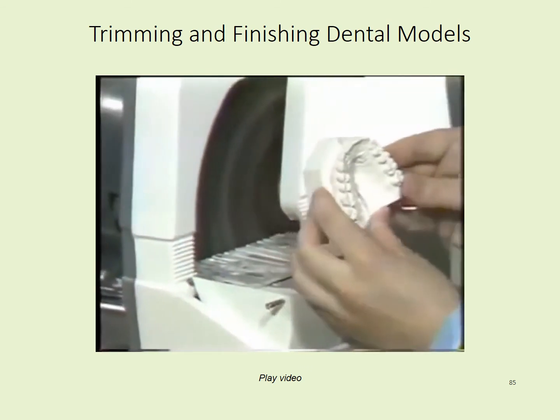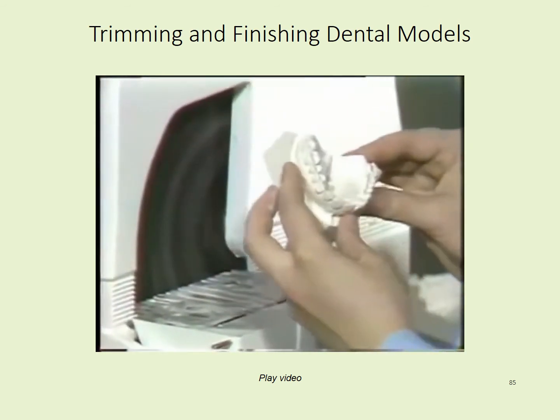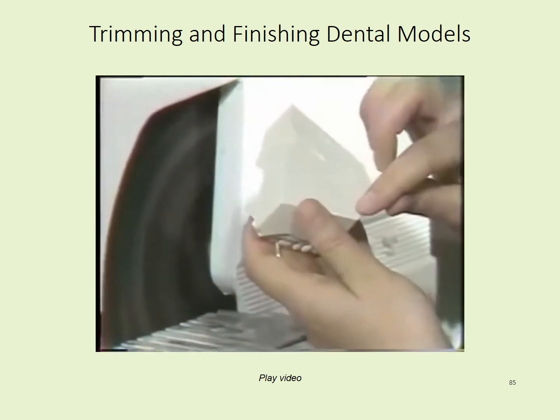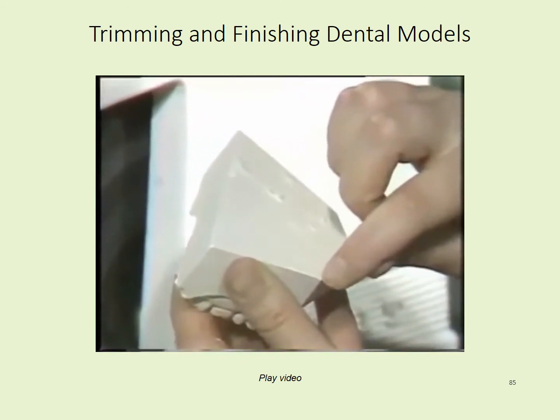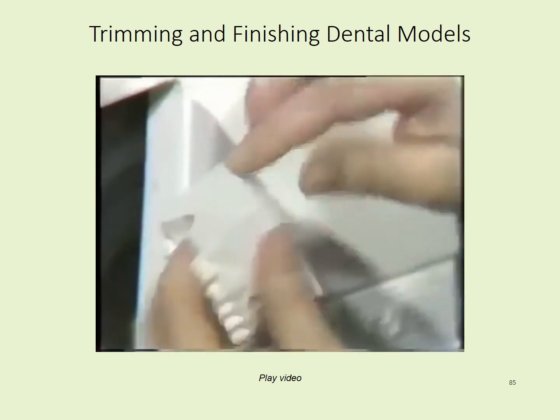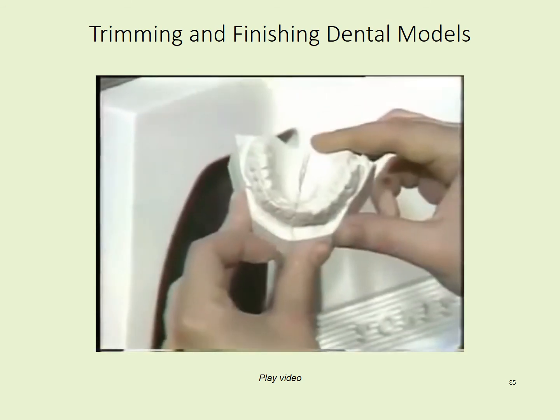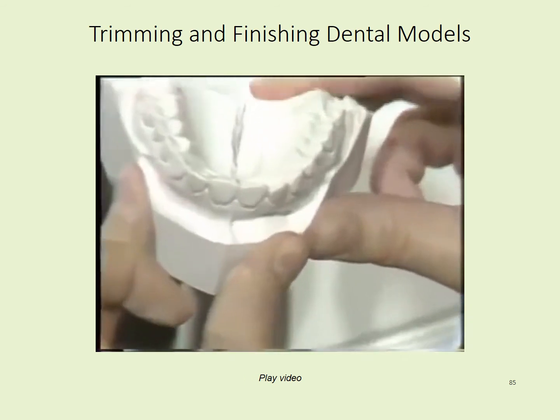After you have your fronts trimmed, you may trim the heels. The heel should be perpendicular to a line drawn bisecting the angle opposite the heel. A good way to get these heels centered is to place your thumbs right on the angle opposite your cuspid.